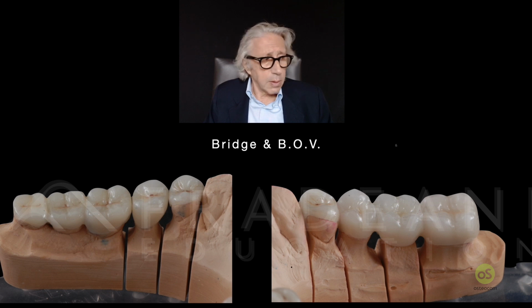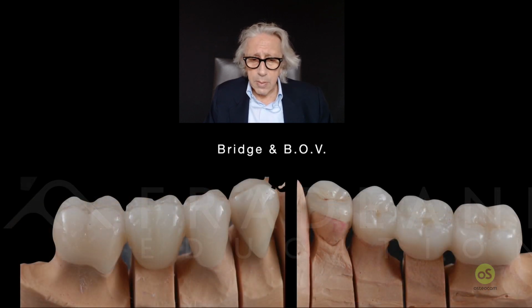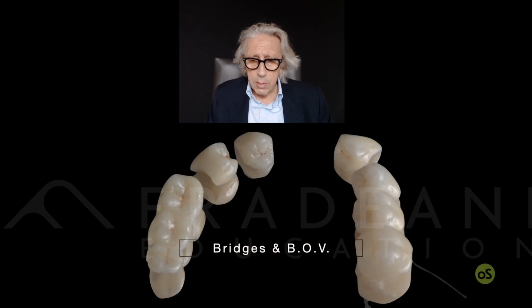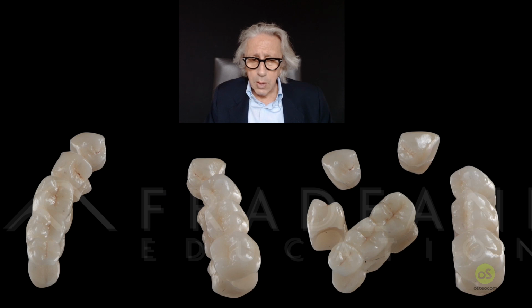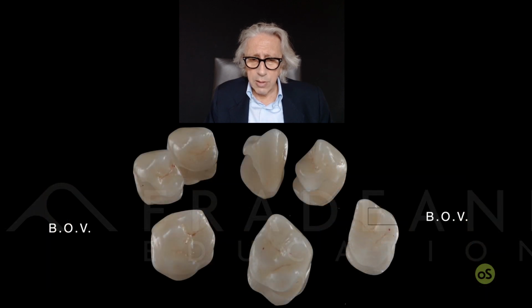Lingual part, bridge and buccal occlusal veneers. That's the lower arch, all the ceramic work in lithium disilicate in this case, and with the bridge we did again zirconia material.